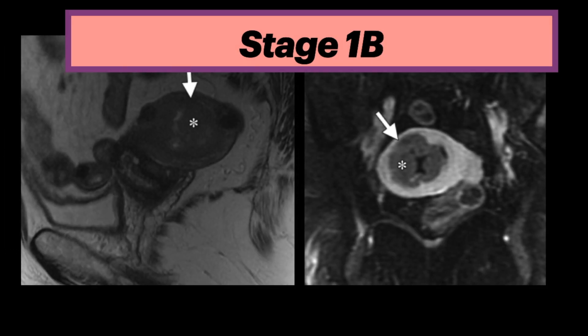The axial oblique dynamic contrast-enhanced MRI, obtained 4 minutes after IV injection of contrast, shows the arrow pointing at the hypoenhancing tumor relative to the hyperenhancing myometrium. This is an example of stage 1b endometrial cancer. The sagittal T2 shows a large iso- to hypointense endometrial tumor with poor tumor-to-myometrium contrast, and the contrast-enhanced axial oblique image shows tumor enhancement with invasion of the outer half of the myometrium.